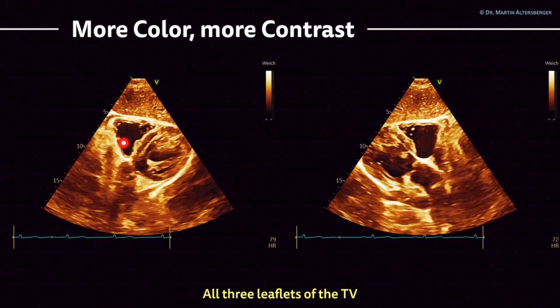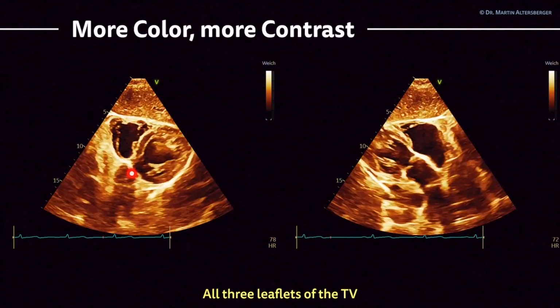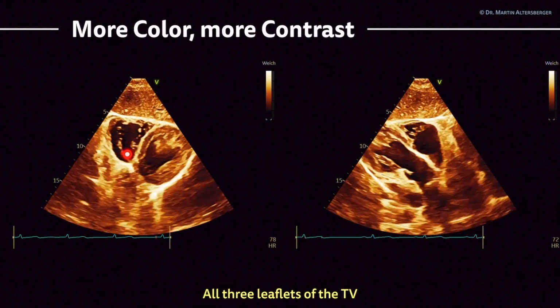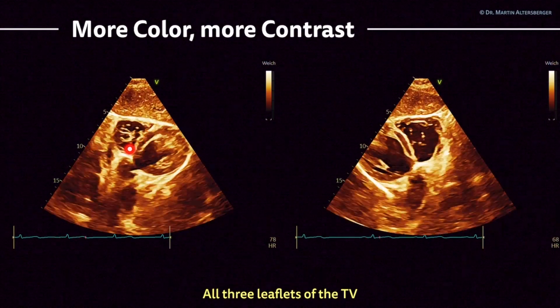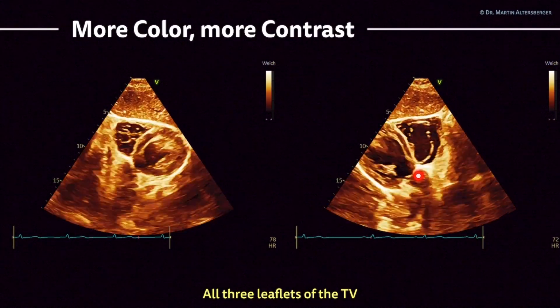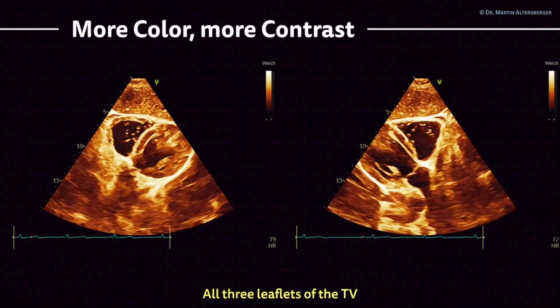And here you have these two images from different angulations. This is almost a 5-chamber view, but more rotation towards the short axis, where you see the aortic valve. Here you have the RVOT briefly, and all the 3 cusps of the tricuspid valve. In the same patient, when you rotate towards the long axis, here you have the left ventricle, the aorta you see, and here the RVOT, and you can again visualize all 3 cusps of the tricuspid valve.